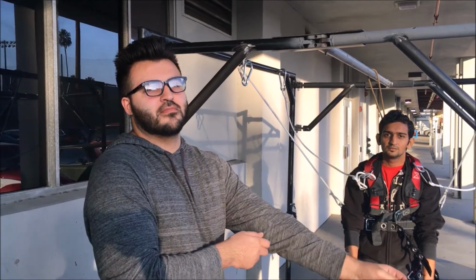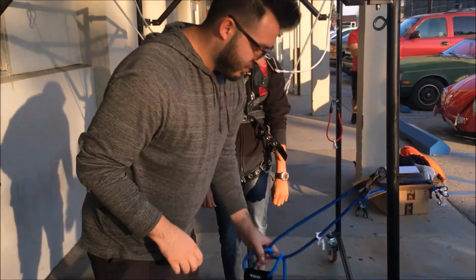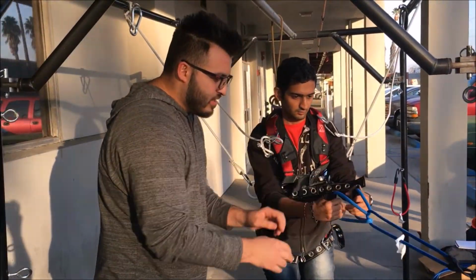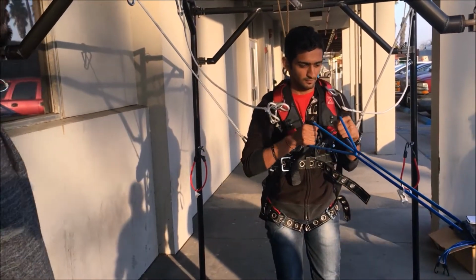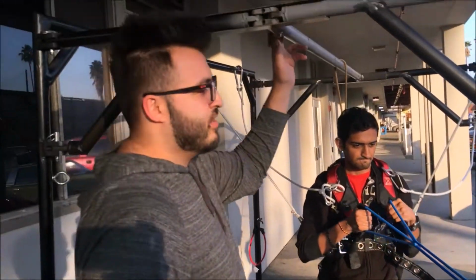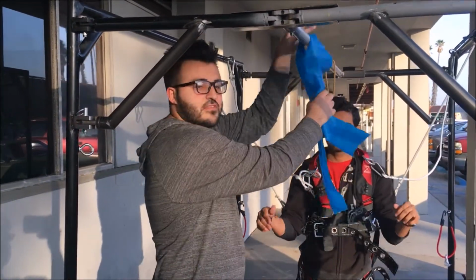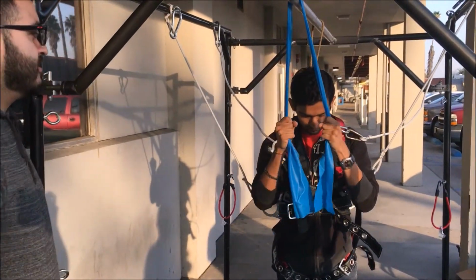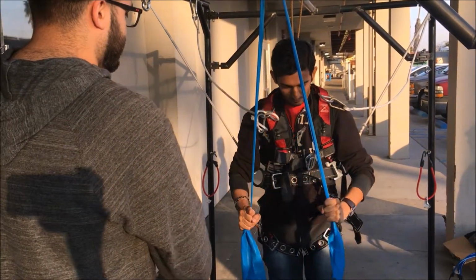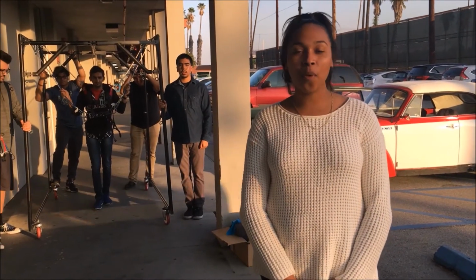So we can also use the spider cage's shape to our advantage to exercise with our client. We can use the hooks up in the front for back exercises and or tricep, bicep exercises. And also the bar at the center can be utilized for different types of exercises. In this case, it will be a tricep exercise. With the addition of the wheels, it could be used as an assistive walking device.